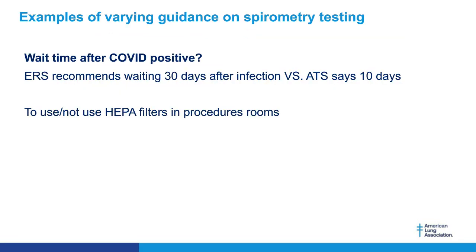A perfect example of some of this variation in guidance is the time after a COVID positive. My medical director and I were researching this because we're seeing a lot of patients now who have had COVID. We have a giant grant funded looking at the more permanent types of lung diseases that we see, and to try to document the type of lung disease that the patients that have had COVID, at least our study is looking at people that were intubated that had COVID, and we're trying to identify what kind of lung diseases.